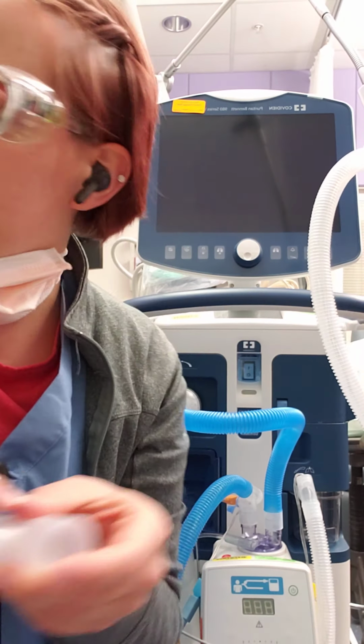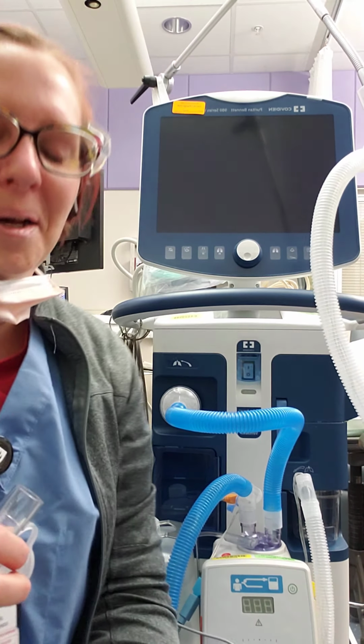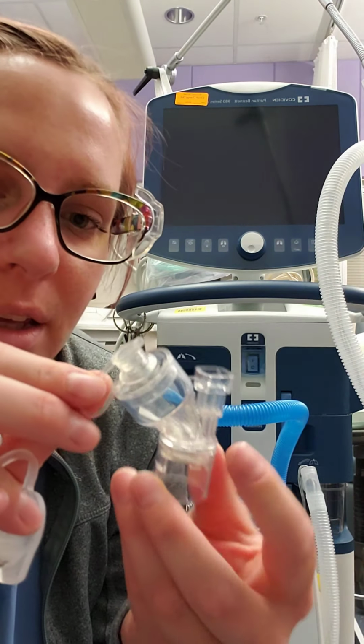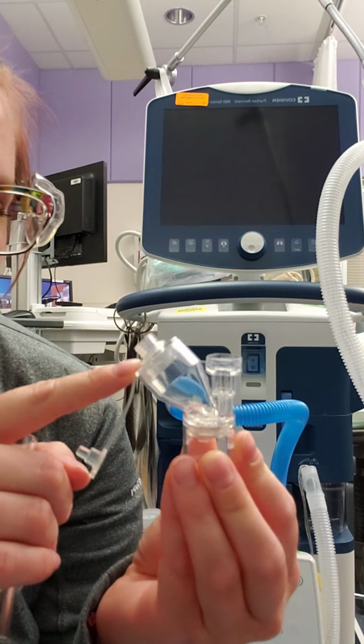The last one I'm going to show you guys is called the Aerogen. I love the Aerogen. It is this little cup here. Has a little closure right here that you open up, and you instill the medication in here.